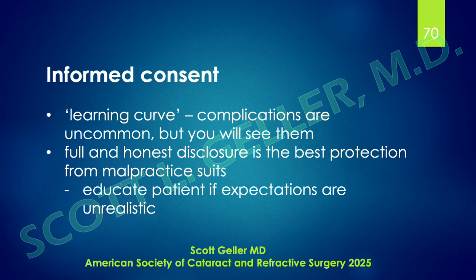There is a learning curve, no matter what the famous doctors in Boston stated in their paper. Complications are uncommon, but if you do enough of this stuff, of course, you'll see them. And, there's the old saying, a surgeon who's never seen a complication isn't really doing surgery. But I think with this stuff, if you're good at what you do, just give them a full and honest disclosure. And, of course, that's the best protection from malpractice suits. Document it in writing in the chart. And educate the patient if expectations are unrealistic.